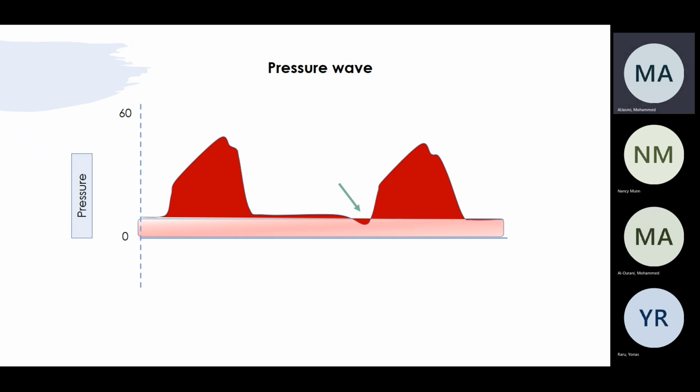But there is a different lecture, there is the SIMV mode, and there are multiple SIMV modes. Sometimes, if you trigger the breath, I will let you do the whole thing by yourself. If you don't trigger it, I will give you the breath. And some of them, if you trigger the breath, I'll give you support to reach a specific volume. Some of them, if you trigger the breath, I will just observe you. If you get enough minute ventilation, I will not touch you. But if you don't get enough minute ventilation, I will help you. So there are multiple different modes that we can use, okay? But that's a different topic.